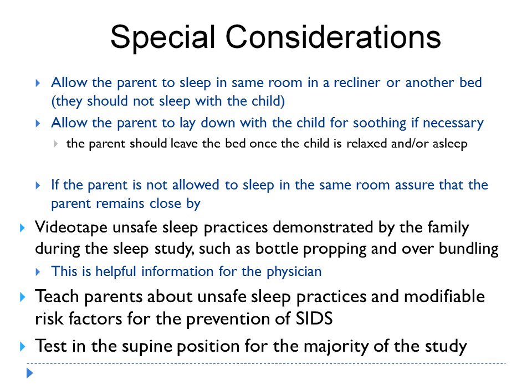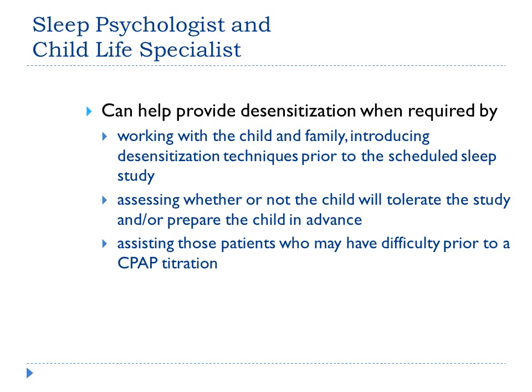Let's go on to our next slide. Sometimes the sleep techs just can't do it all, and you need to seek help with the sleep psychologist or child life specialist. This comes more into play when you're trying to help the child adapt to CPAP.